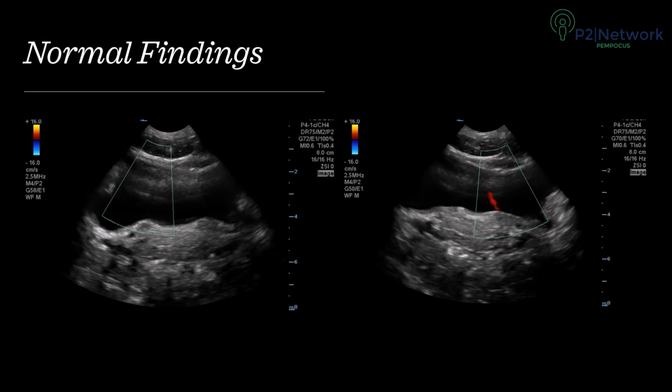The last image showed you that sometimes you can apply the color Doppler across the entire bladder to visualize jets bilaterally at the same time. But depending on the bladder size and your color Doppler box settings, it can sometimes be easier to just look at one side at a time.